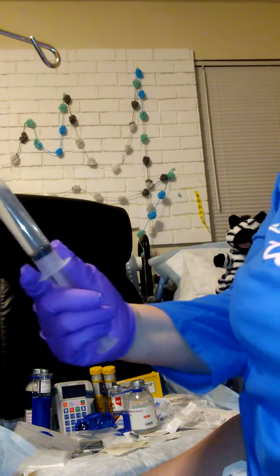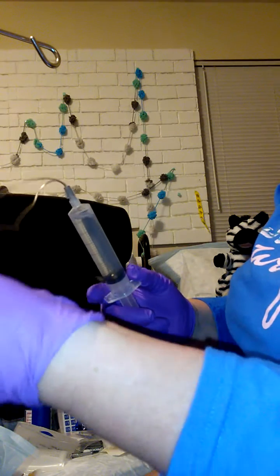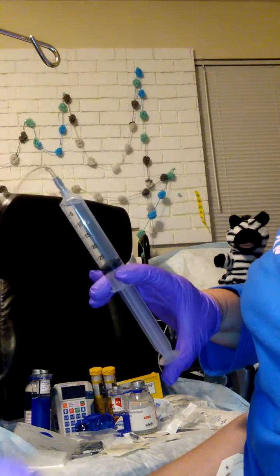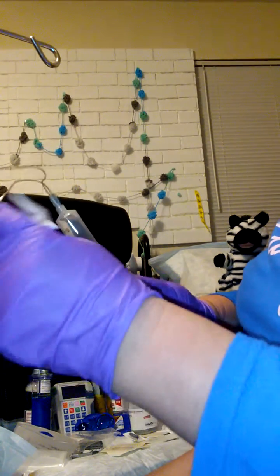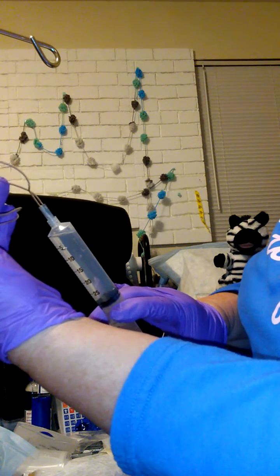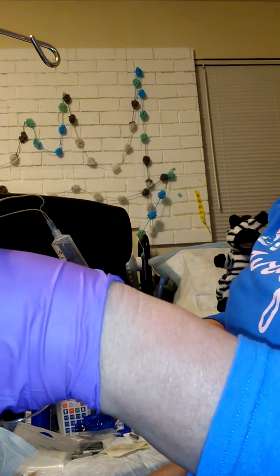Okay, I'm just going to very gently work this up. And I'm telling you now, these tubings are so thin. It's really hard to even see that it's going anywhere. Got a little bit of air right here, but there's tiny bubbles moving. You just get those little tiny bubbles. You can watch them go into this tubing.